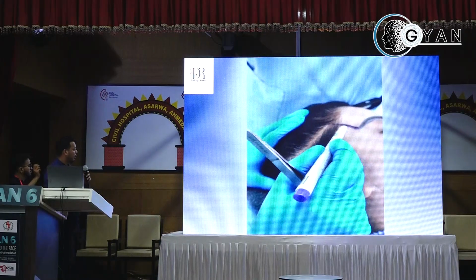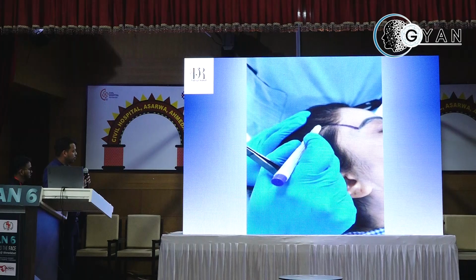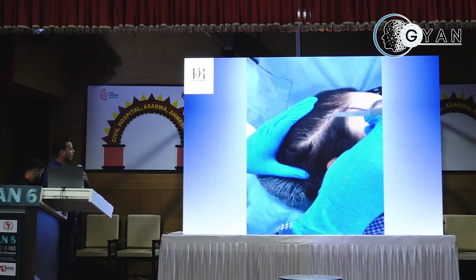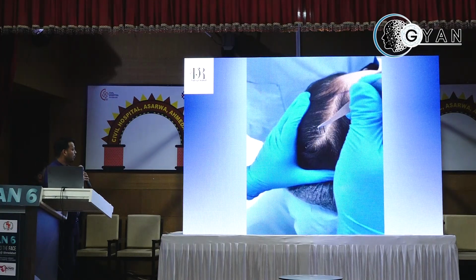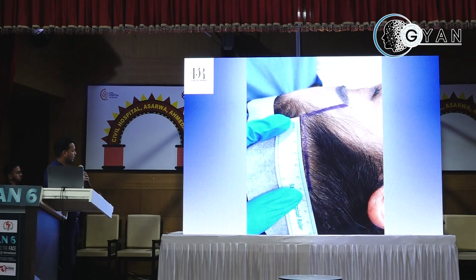So first of all, I just mark the superior line. I tell the patient to bite so that you can feel the muscle. Then after that, we remove the hair follicle, and we don't cut the hair follicle; we preserve it as much as we can. This is my marking.